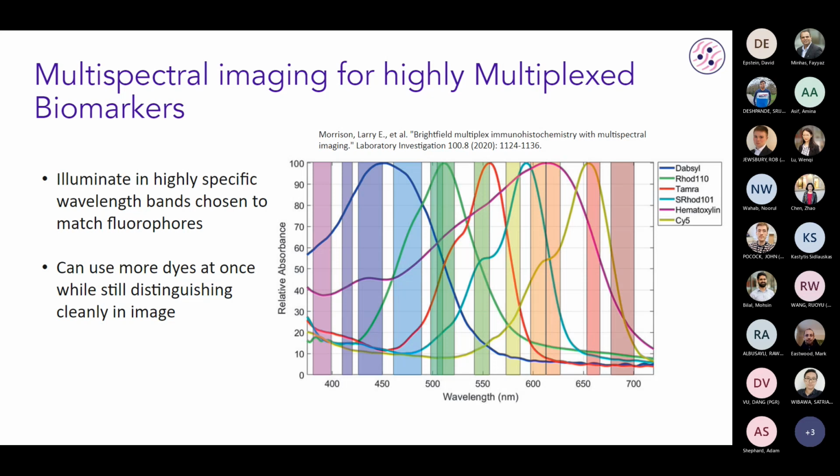Mark, there's a question by David, saying wavelength affects focal length. Is focusing different colors a problem when making images? Not that I've found. I haven't looked too much into the specific technical details of the microscopy setups for some of these, so whether you have to add any extra focusing in there or not, I'm not sure.